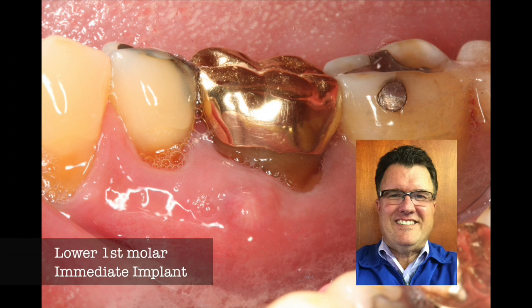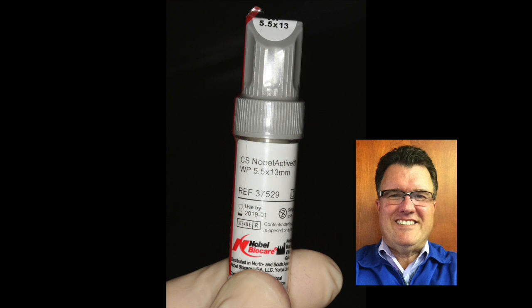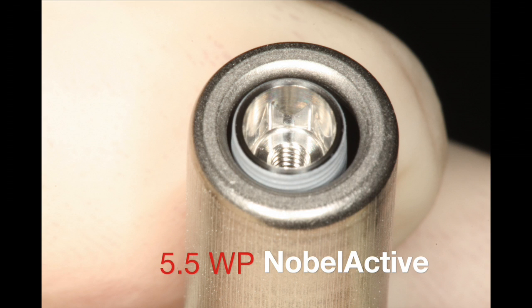This is Dr. Scott McLean and this is a YouTube video about implant dentistry. In today's case, we will be extracting a lower molar and then placing a 5.5 by 13 millimeter Nobel Active Wide Platform implant.